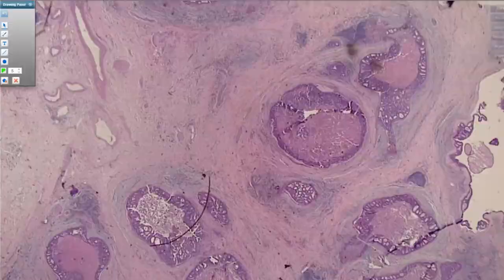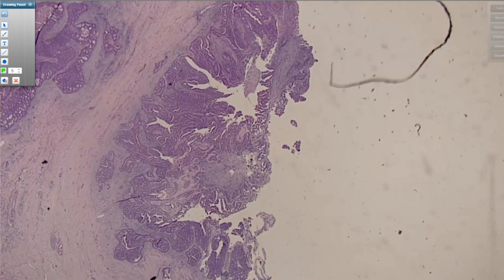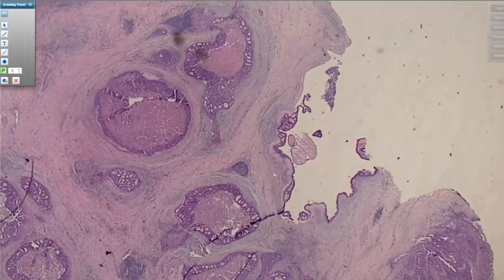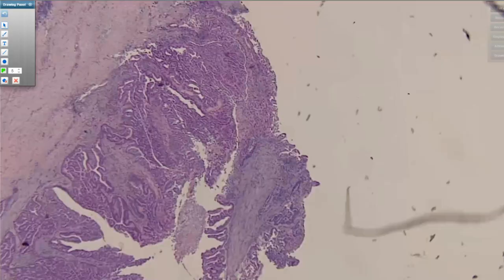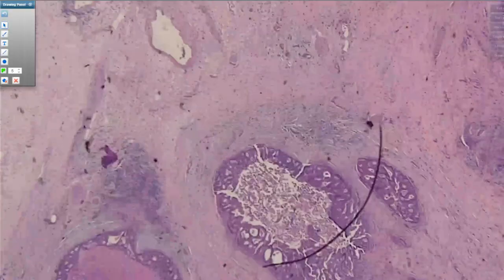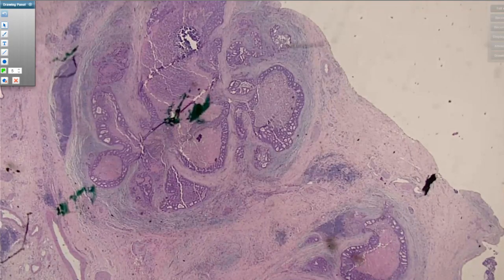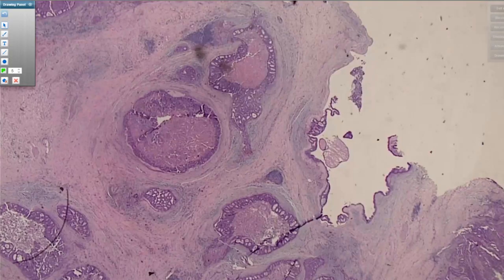But overall, it can be pretty tricky, and unfortunately in the pancreas we don't have a marker like we do in the breast, myoepithelial markers, or basal cell markers like in the prostate, and so we just have to, again, evaluate the whole cyst and do our best to estimate how much is invasive. But again, even though these commonly have invasion associated with them, they do seem to do much better than invasion arising from other cystic lesions.